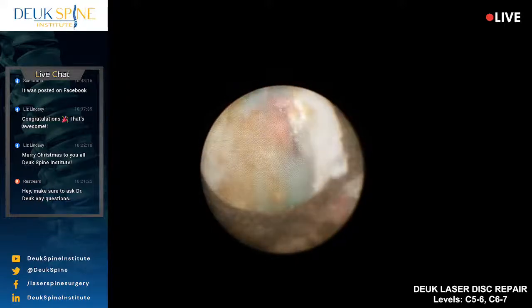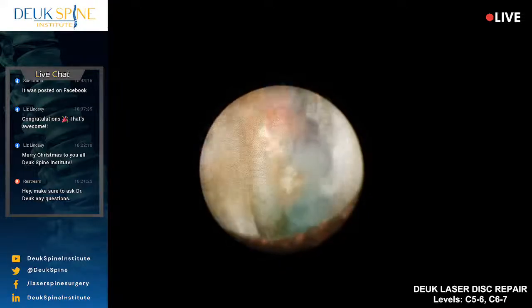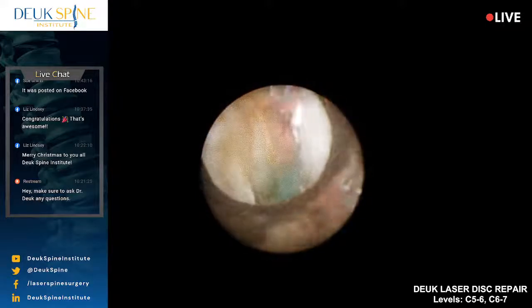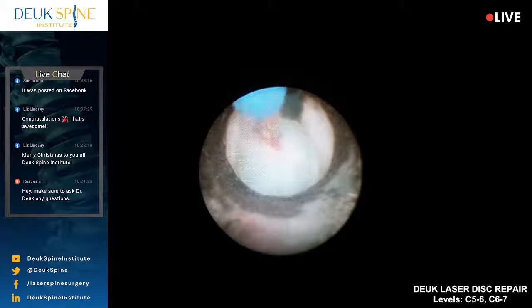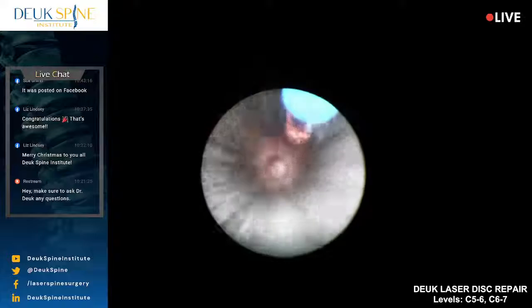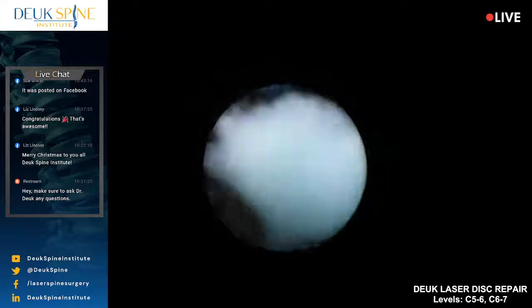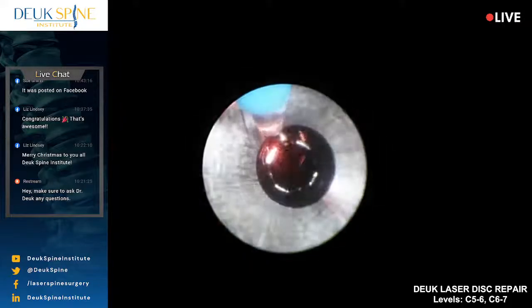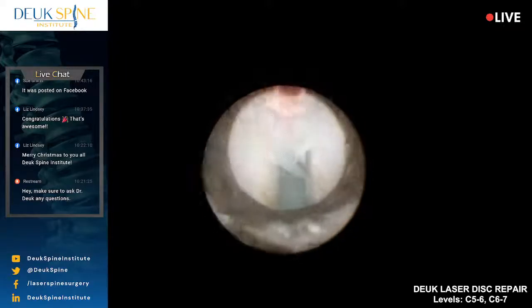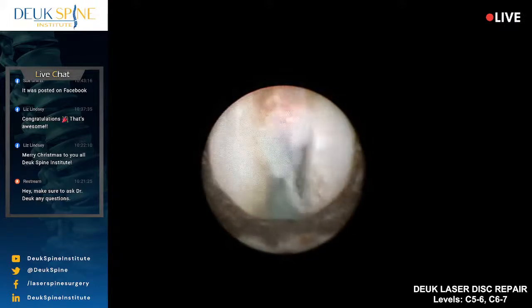But a real laser, a real surgical procedure like the Deuk laser disc repair, our lasers can melt steel. And they do, by the way, melt steel. They melt our own steel. If you look at the wall around this tube at the end there, see all that dark discolored stuff? That's from laser blasts melting the steel. That's melted steel, surgical steel down there. Okay, so absolutely we melt steel. I'm not trying to melt steel, but sometimes the jiggling of the laser, it jiggles against the sidewall of the tube and it causes that steel to melt.